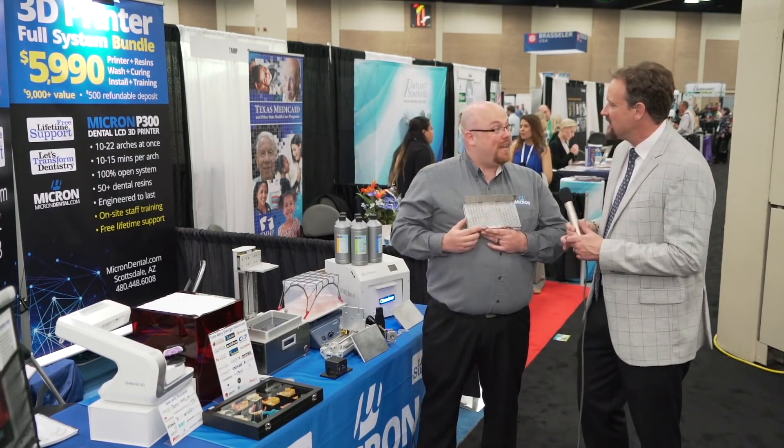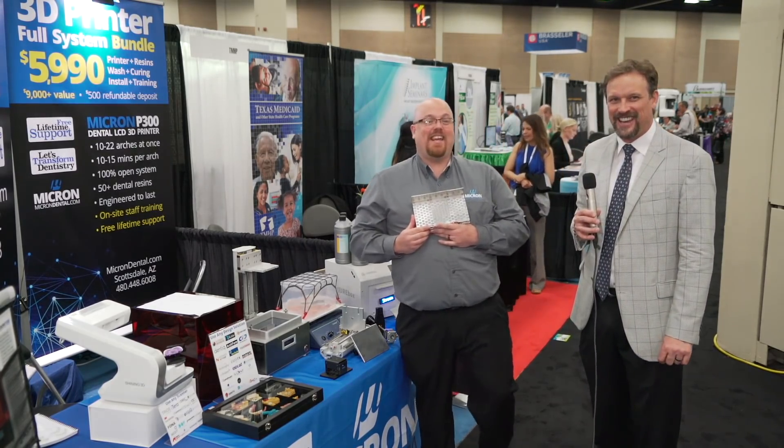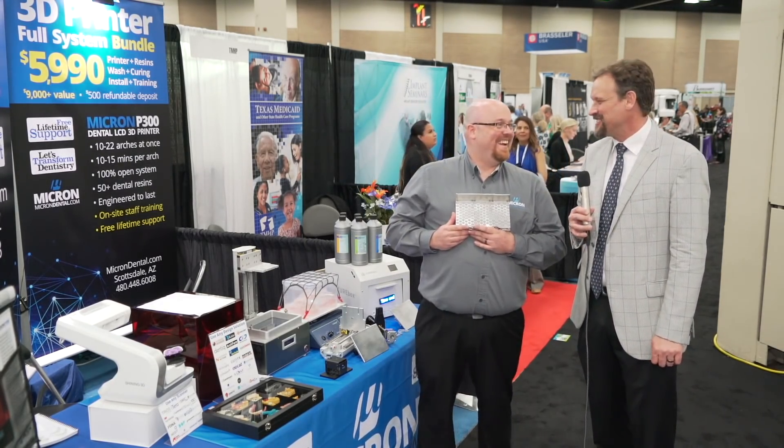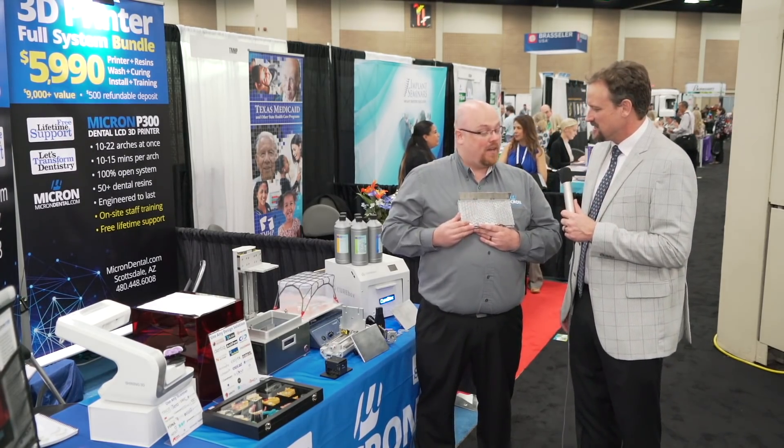So we're using a distributed LED matrix. These are all UV LEDs — they're 405 nanometers.